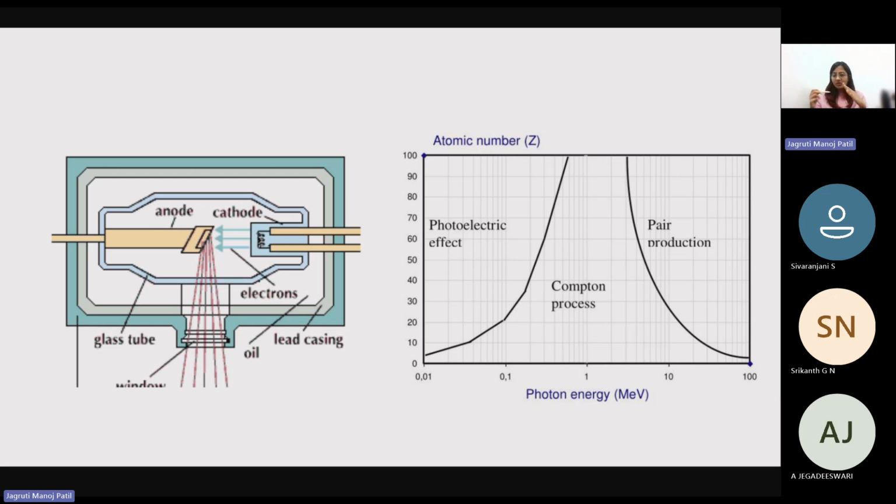And when these electrons strike it, if there's a heavy metal inside, like tungsten, then the X-rays are emitted divergently below it. The angle between the incident and the reflected, you see a 90-degree angle of reflectance there. That's how you know those are the X-rays being emitted divergently. So that's how it works.